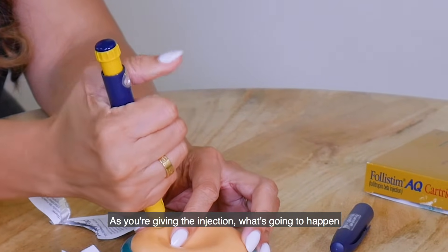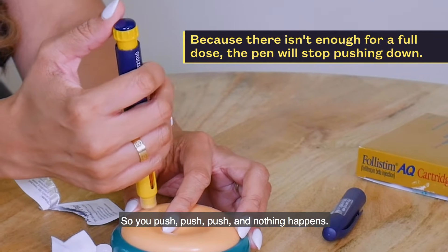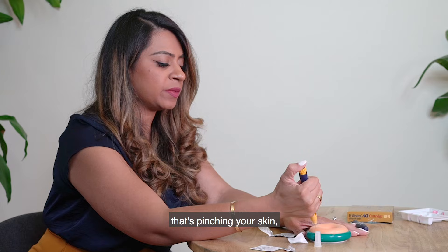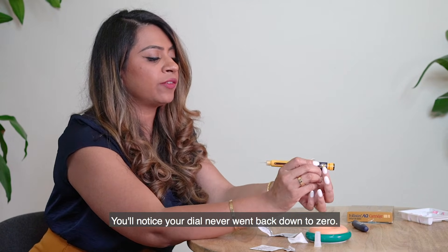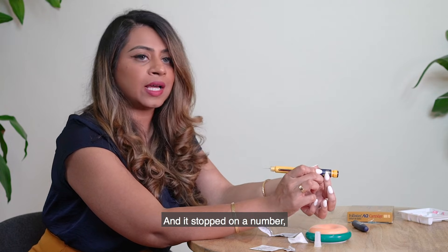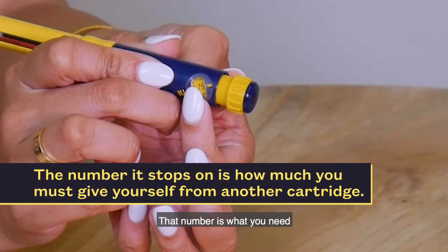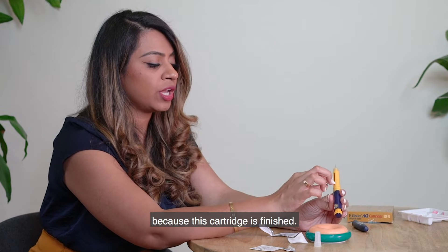As you're giving the injection, what may happen is it will stop and not go any further — you push and nothing happens. Let go of the hand pinching your skin, hold the needle for five seconds, then remove it. You'll notice the dial never went back to zero and stopped on a number — say it stopped on 75. That number is what you need to give yourself from another cartridge, because this cartridge is finished.